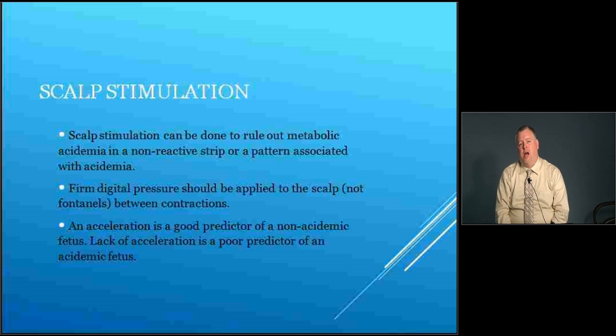Scalp stimulation can also be done instead of acoustic stimulation to help rule out metabolic acidemia in a non-reactive strip or a pattern associated with acidemia. To do that, you apply firm digital pressure to the scalp, you should avoid the fontanelles, and you should do this between contractions. If you get an acceleration from that, it is still a good predictor of a non-acidemic fetus at the time we observe it. And again, a lack of acceleration is a poor predictor of an acidemic fetus.